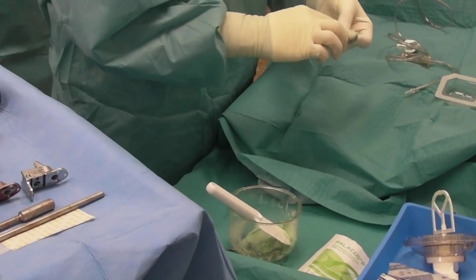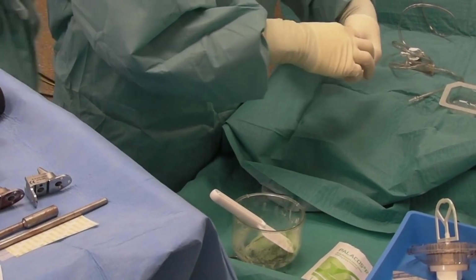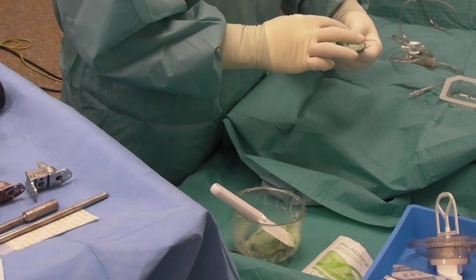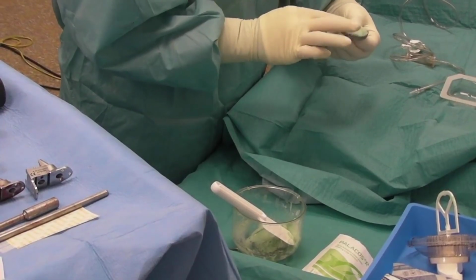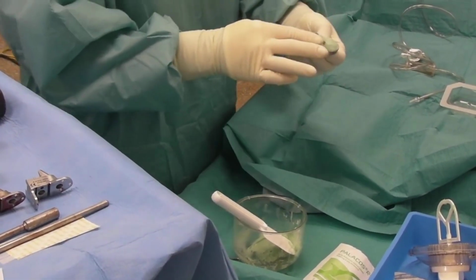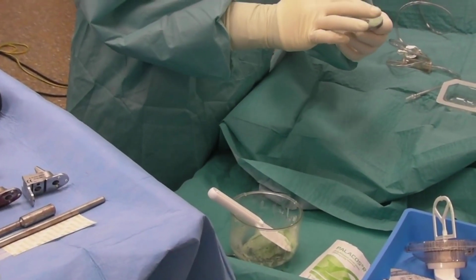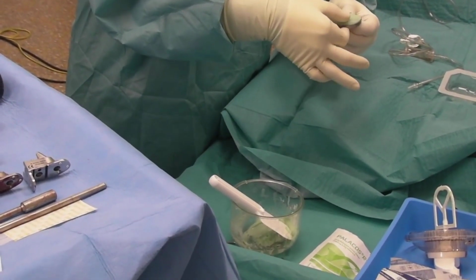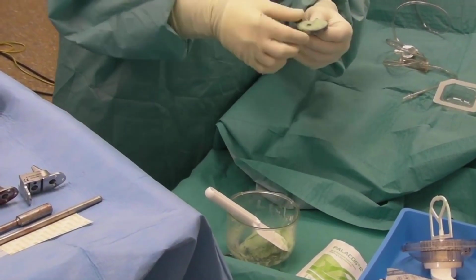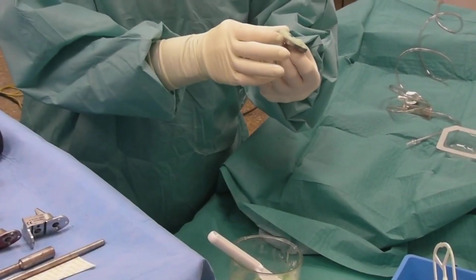with the cemented prosthesis. The cement I mentioned earlier is a type of glue that is prepared under vacuum by mixing a powder that polymerizes after adding a liquid that triggers a reaction, resulting in a paste that is spread on the part of the prosthesis that will come into contact with the bone, thus ensuring immediate stabilization.